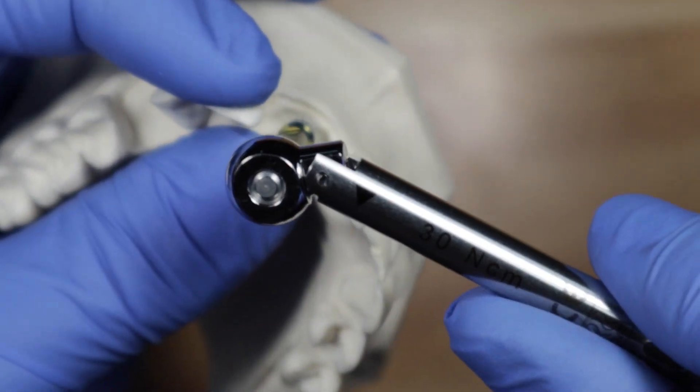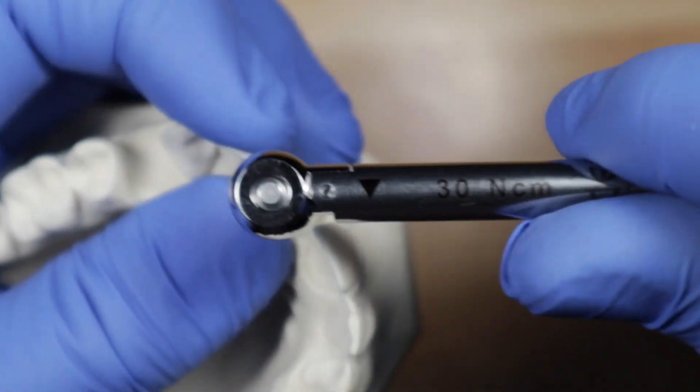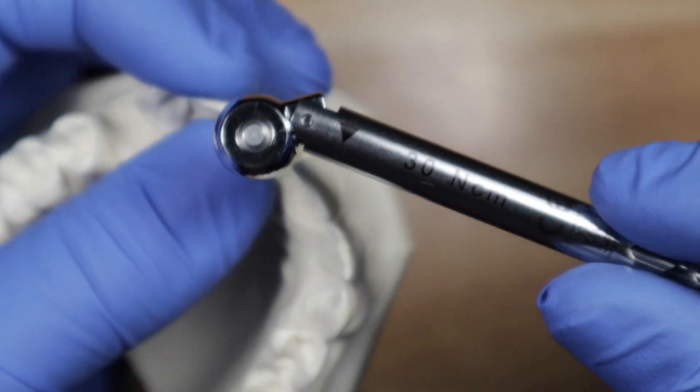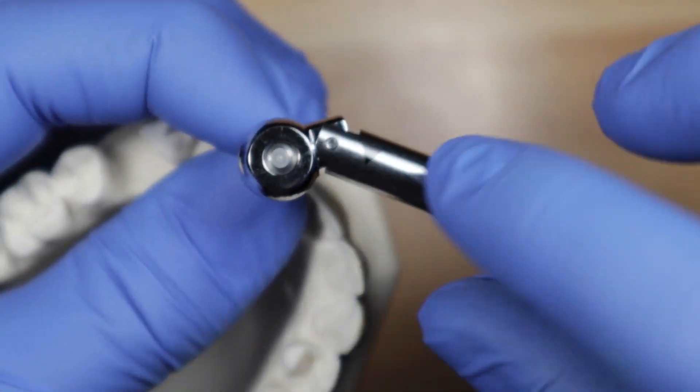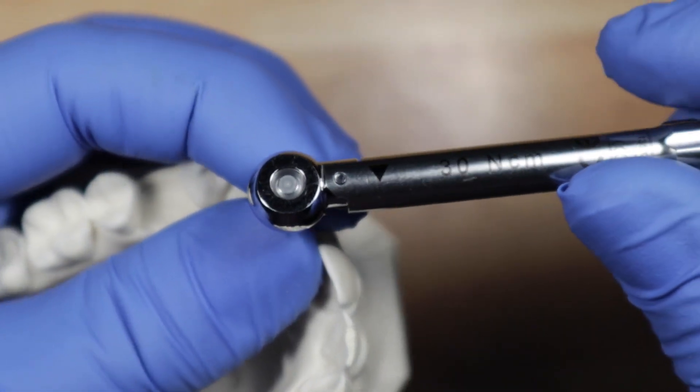So you turn it that way and it breaks, right? It gives, it like kinks right there at 30 newton centimeters. So at 30, it tells you to stop so that way you don't over torque it.